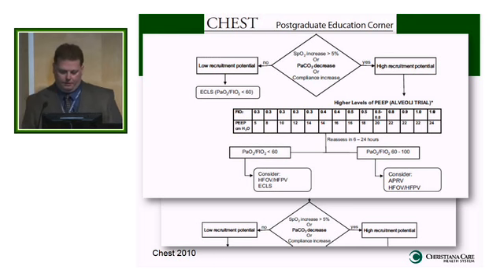actually bring up the diagram a little higher here. So this is the next step they're at. You do increased PEEP, recruitment maneuvers, and if they are showing high recruitment potential, then you do some other things. You start considering in this branch down here, APRV, high frequency, and if they're not very recruitable, you may start thinking about ECMO.